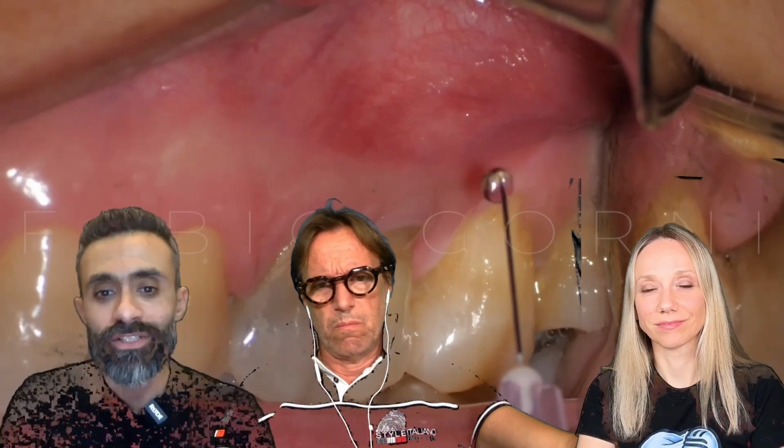Yeah, that was informative. And let me ask you about one of the most important steps in the workflow after planning and decision making, of course, which is the anesthesia. What are your techniques and tools in posterior surgery for anesthesia? Because it also has an impact later in the procedure on hemostasis.